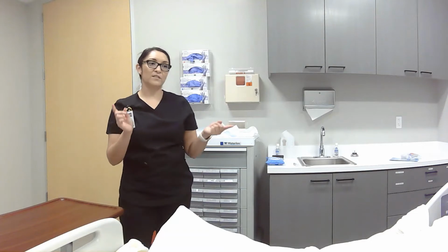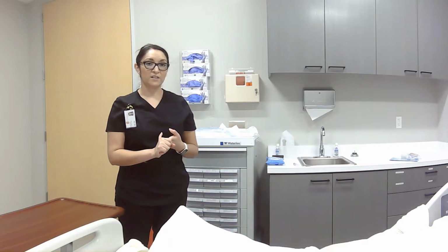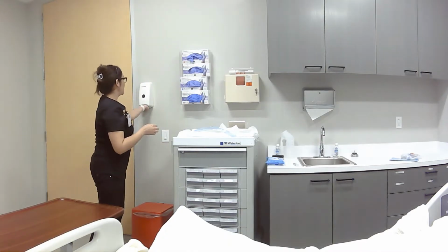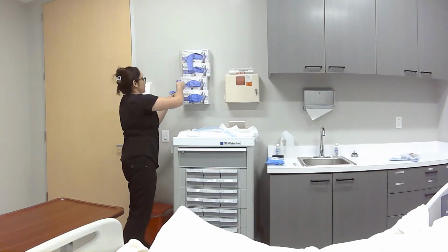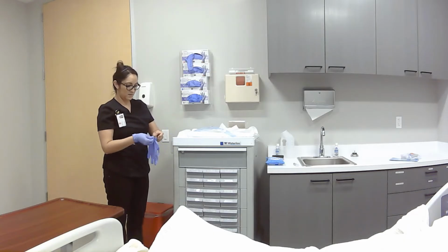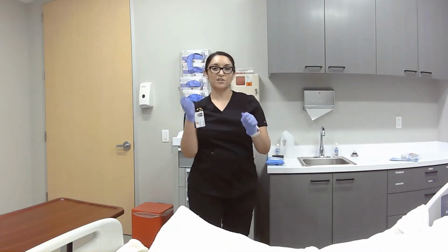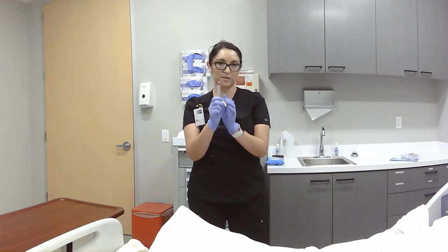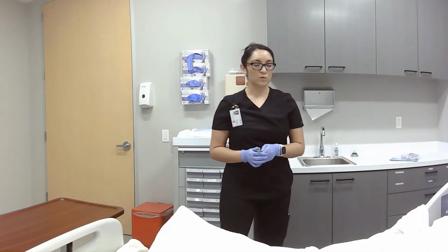So in order to do that, we're going to verify the doctor's orders. We're going to make sure that we verify our patient. But first, I'm going to do some hand hygiene, and I'm going to put on my gloves before I go into her room. Okay. So I verified the order. You also want to bring your supplies, so you're going to bring in your 10 cc blunt tip syringe, which is going to be used to remove the sterile water from the balloon. And we'll come into the room.